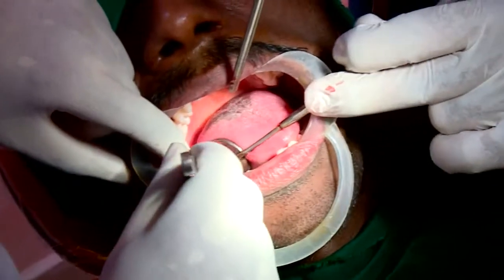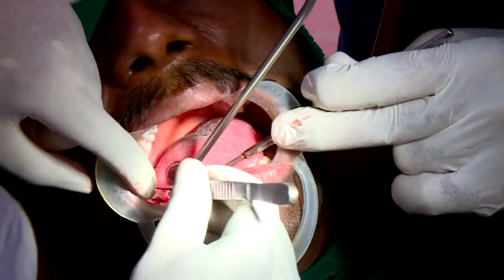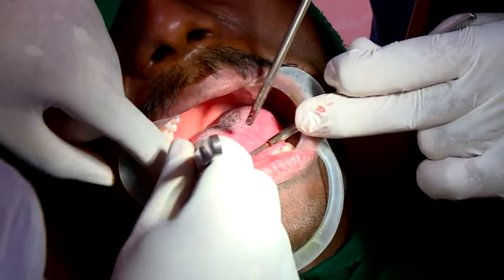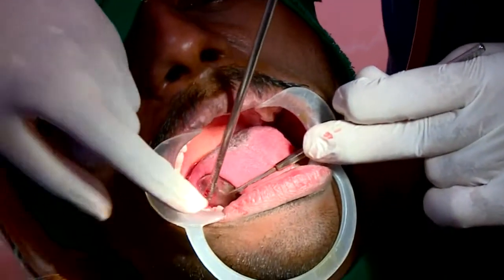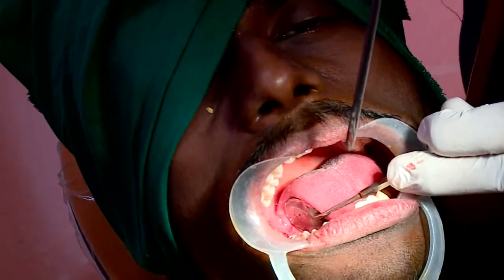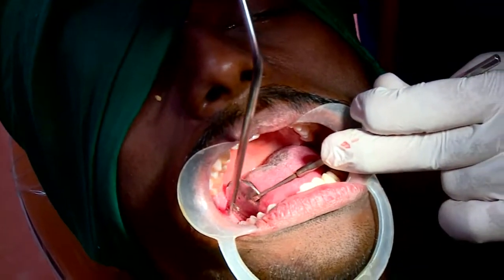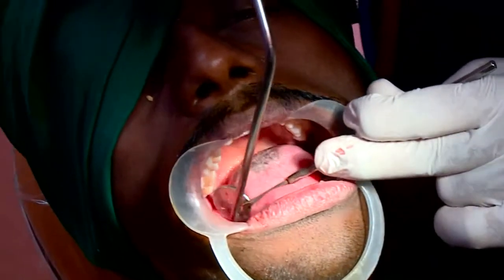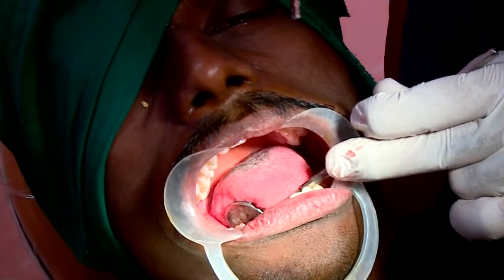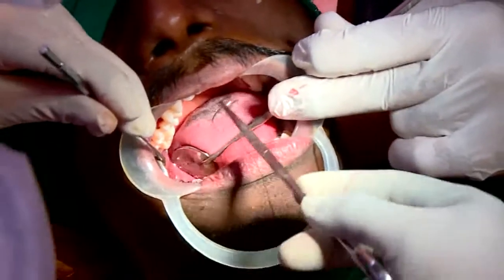Are you all clear in the steps? Good anesthesia, then exposure. Sir has elevated the flap using a modified Ward's incision. After that, he has done buccal guttering and distal guttering of the bone. Since the tooth was locked, a horizontally placed tooth, sir wanted to split the crown and the root separately. So he made an oblique cut, basically from up to down.